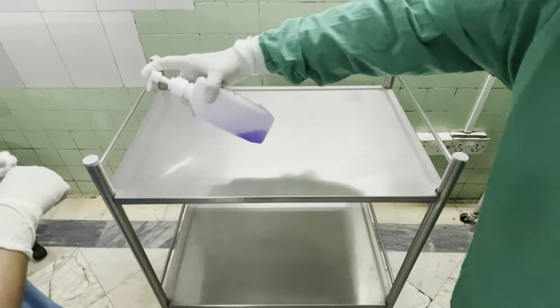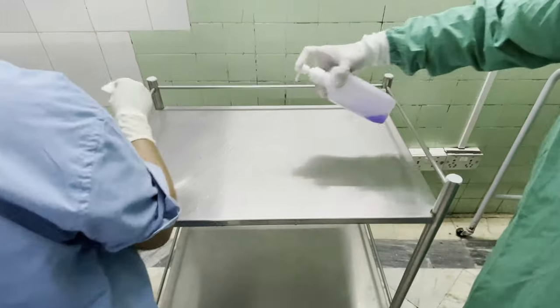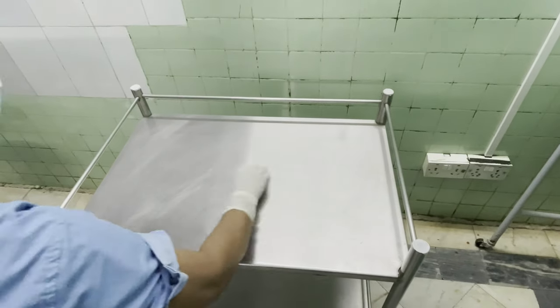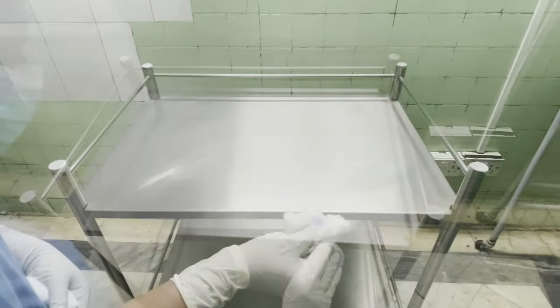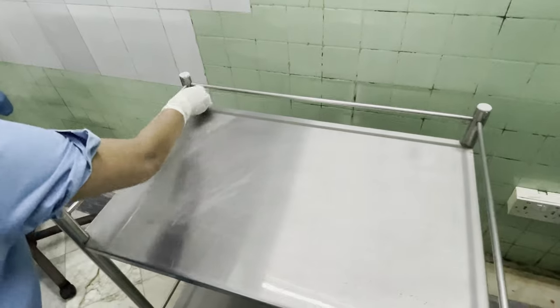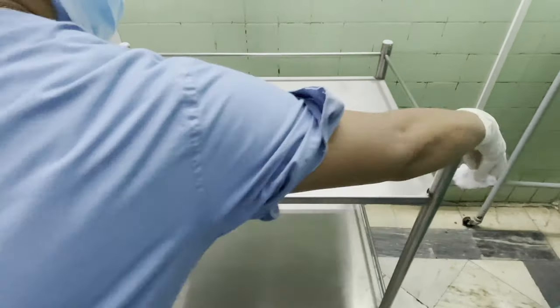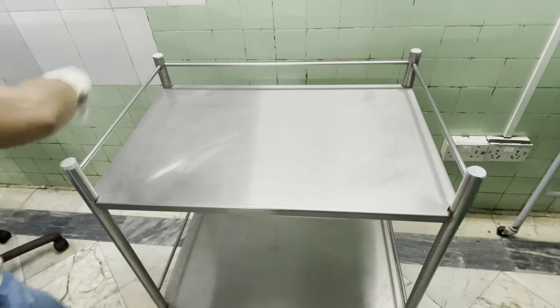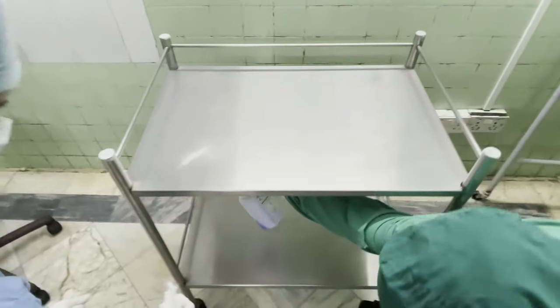So, the operating trolley is cleaned with spirit as demonstrated. First, the surface of the trolley is carefully and thoroughly cleaned. Following this, the sidebars on all three sides are carefully cleaned. After which, the lower part of the trolley is also cleaned as demonstrated.